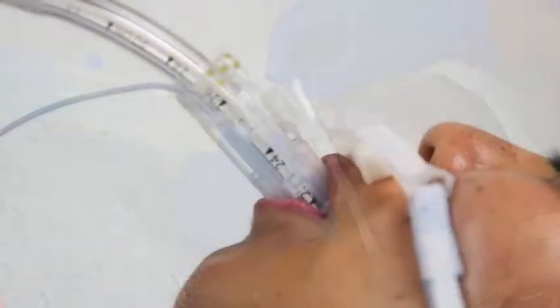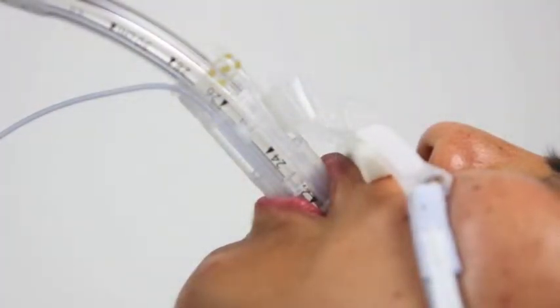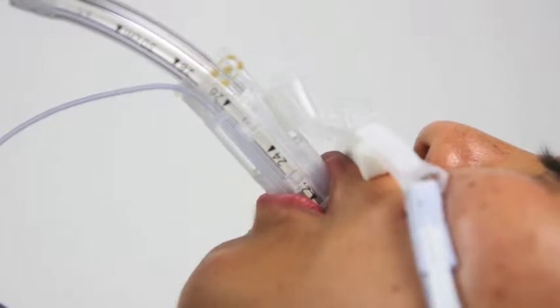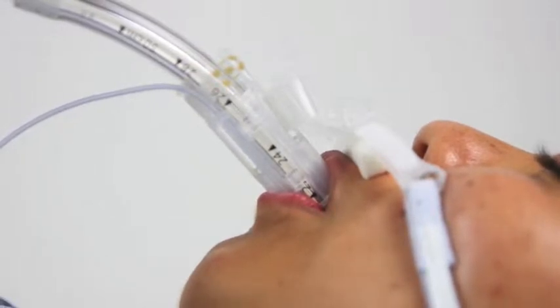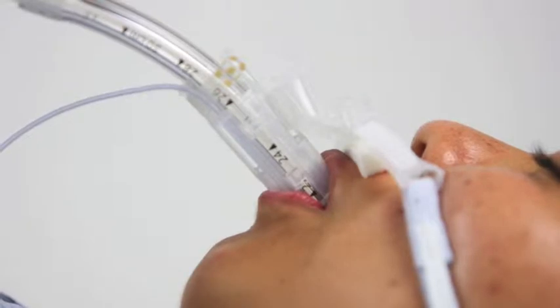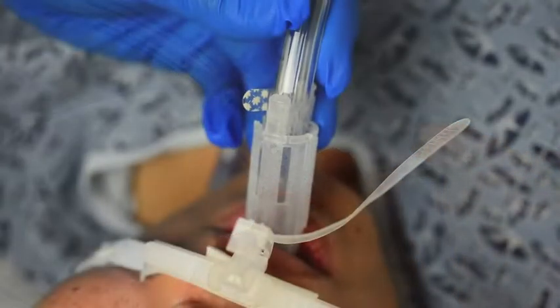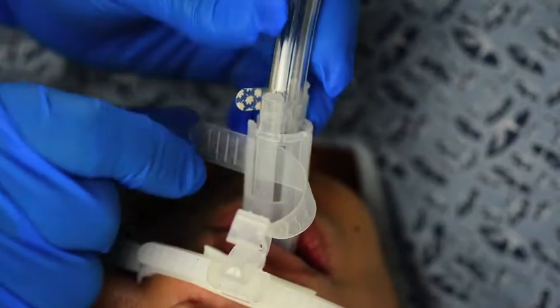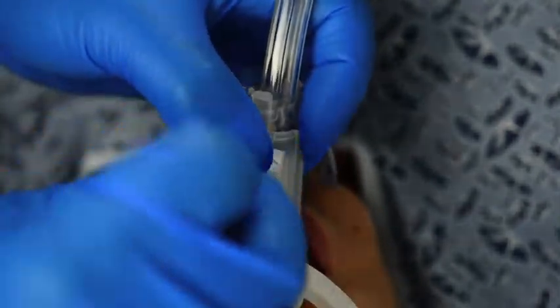At this point, make sure to rotate the ET tube and align the Auto Light so the ET tube centimeter markings line up in the Auto Light side windows. You can then verify ET tube placement and alignment before securing the strap of the Auto Light. Once the correct position of the ET tube is confirmed, slide the fastener strap into the clasp and shut.